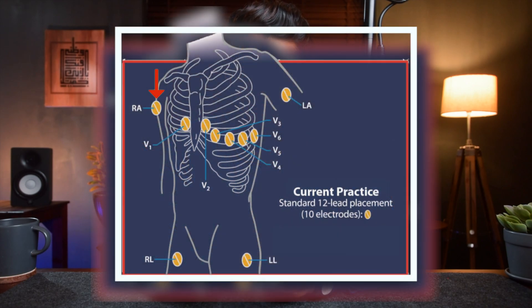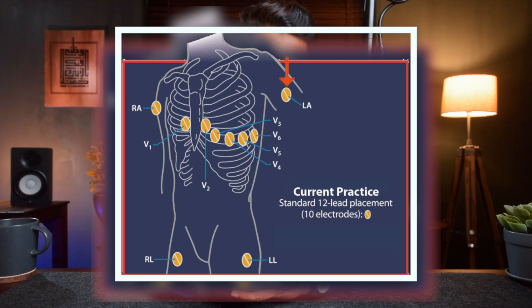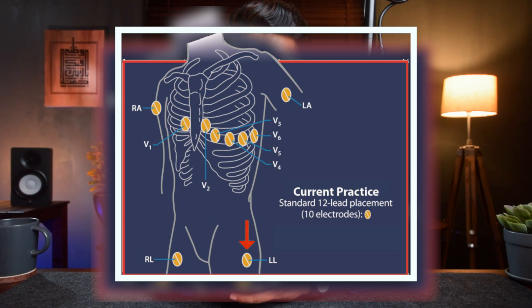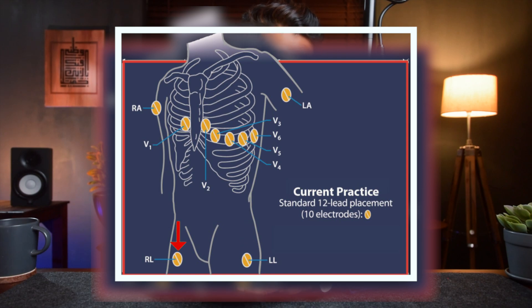Next, apply the electrodes to the patient's arms and legs — again, make sure they're placed in the correct positions. Red marked with the letter R is for the right arm. Yellow marked with the letter L is for the left arm. Green marked with the letter F is for the left leg. Black marked with the letter N for neutral is for the right leg.